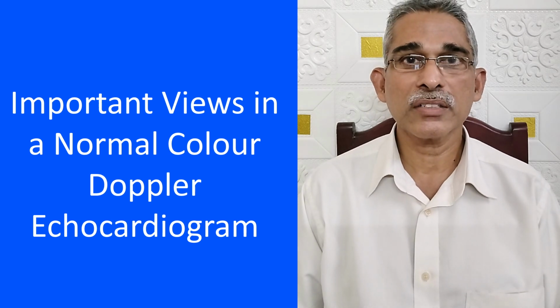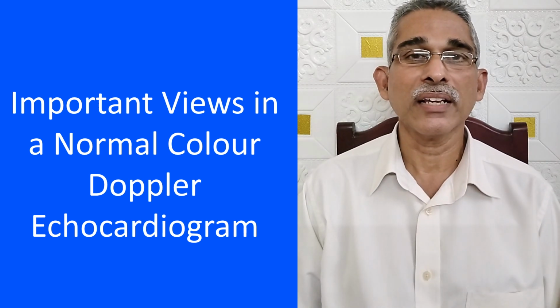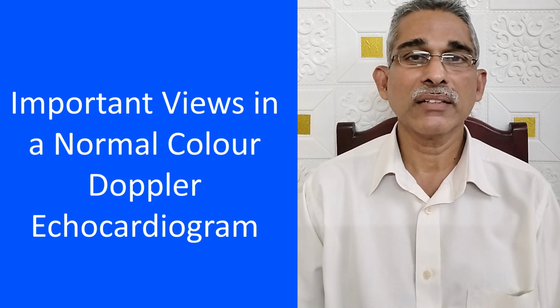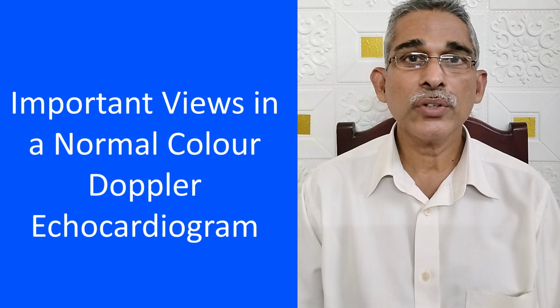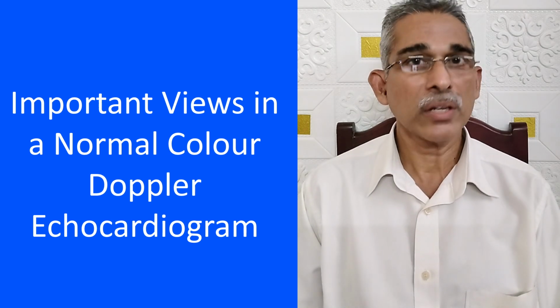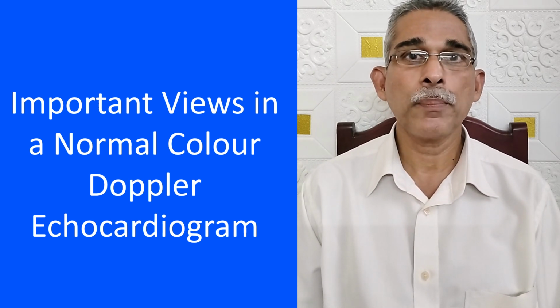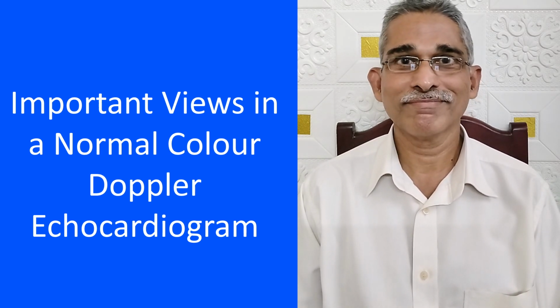In postoperative patients, we know that volume status assessment is very important. For that, if the central part is covered by dressing, then you have to go by the infra-axillary view towards the right side. Then you will be able to see the inferior vena cava well. All these views may not be obtained in every patient. It depends on what you are looking for. Then we'll view some of the video clippings commonly used in adult echocardiography in a normal color Doppler echocardiogram.